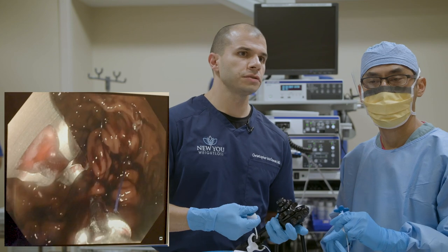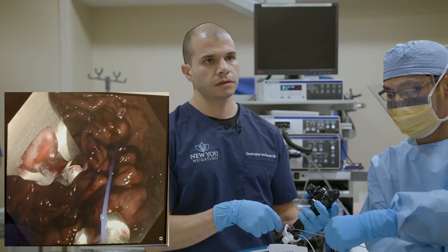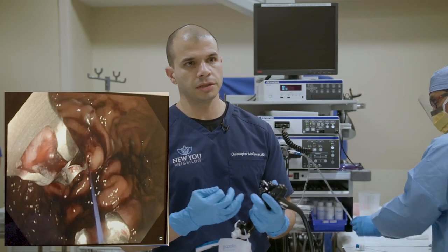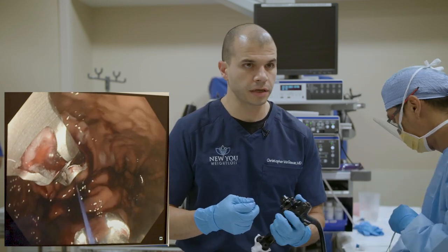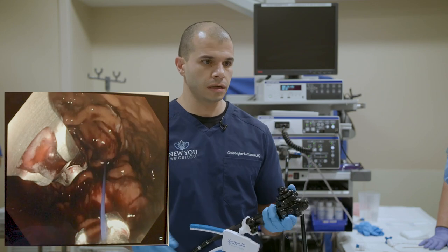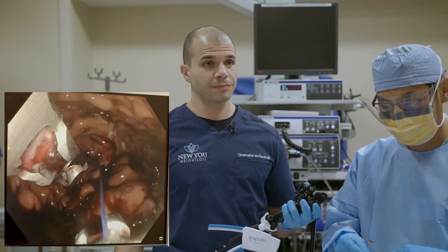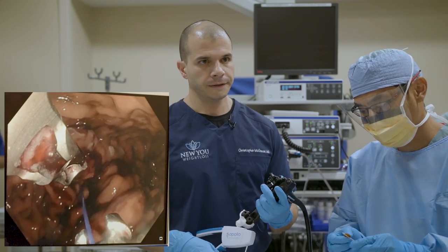Question from Shoshana: how many sutures do you typically use? I mentioned an average of about six, depending on the patient and how things are coming together. If you want, as high as nine — for a really small stomach we can complete this in four sutures, but we generally like to have around six on average.